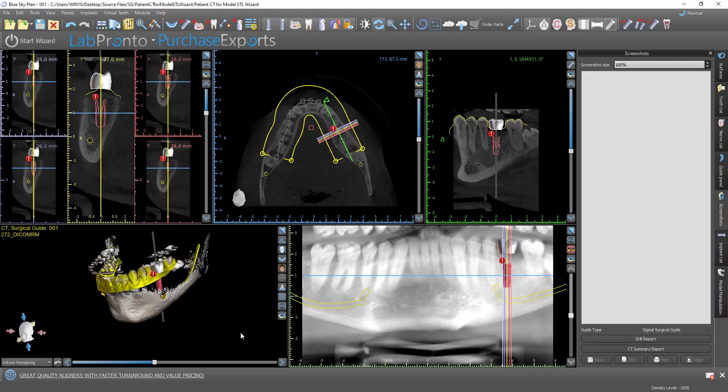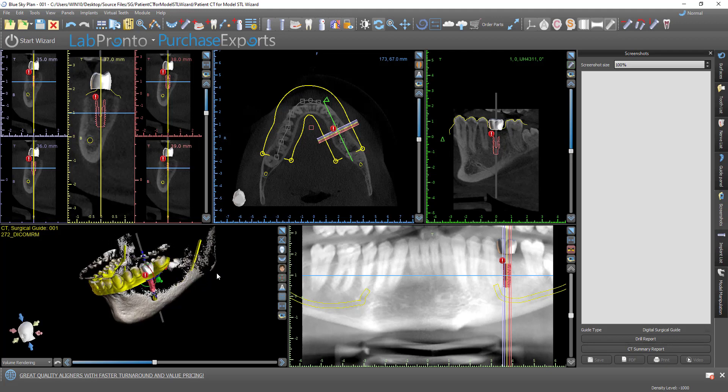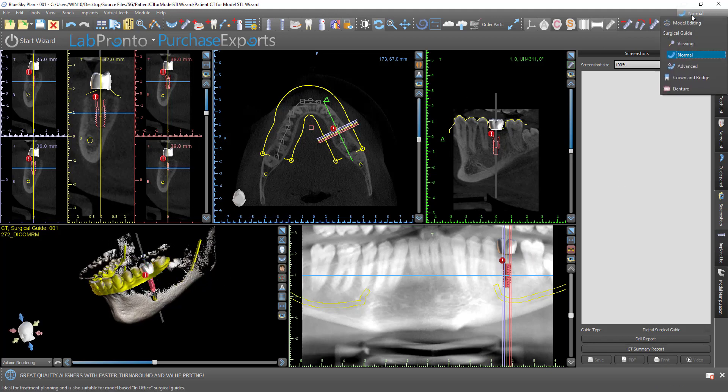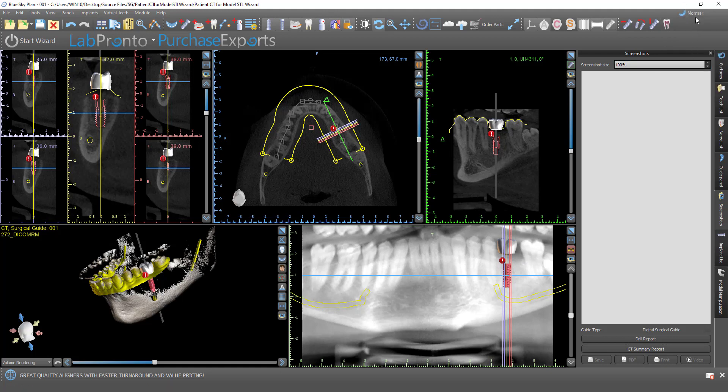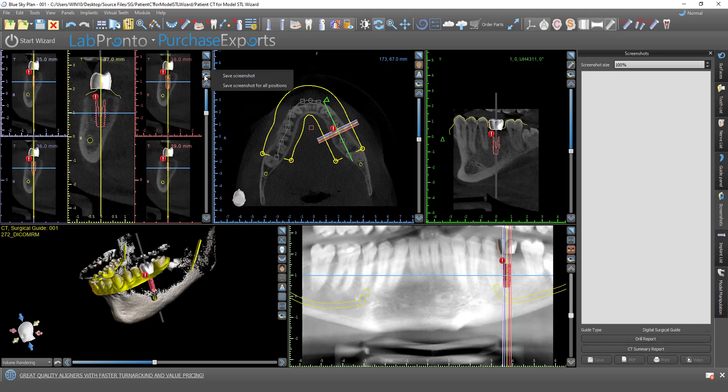So now in our surgical guide module, for example, you could generate and export the video as well. We're now in normal mode. Works exactly the same way in advanced mode. We're looking now at our screenshots panel. And you could see in the icons in the top right corner for every view, you have a little picture of a camera. So if you wanted to add a screenshot to the screenshot basket, you could just click save screenshot or save screenshot for all positions.